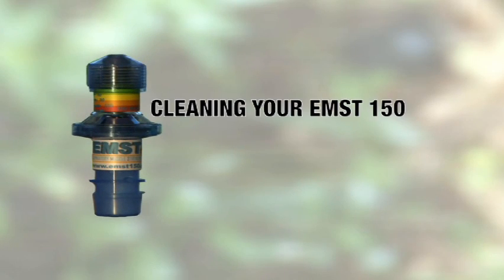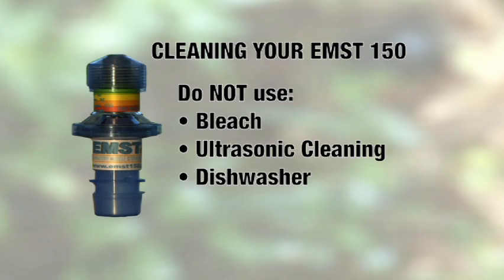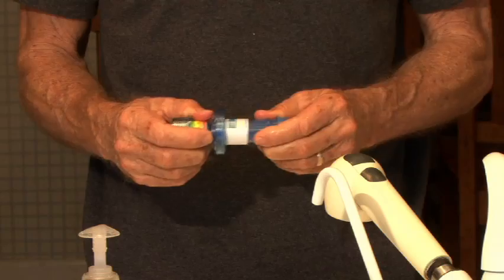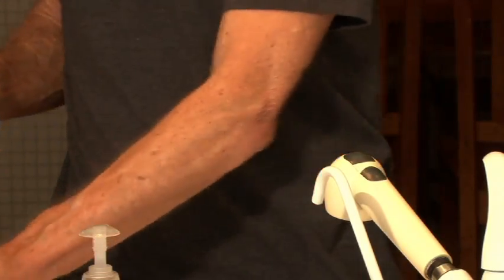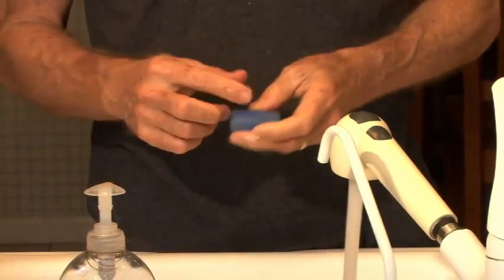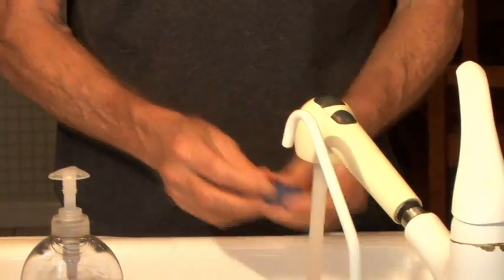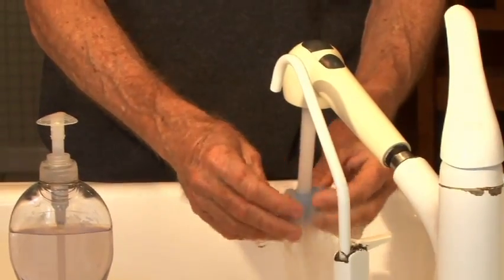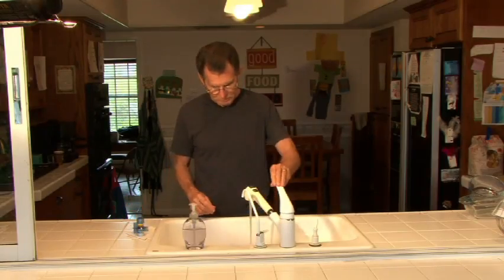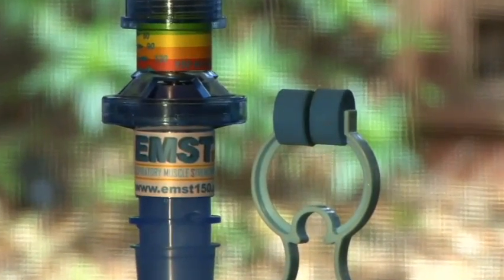Your EMST 150 trainer should be cleaned weekly. Do not use any harmful cleaning agents such as bleach or ultrasonic cleaning. The trainer is not dishwasher safe. In order to clean it, simply remove the mouthpiece from the unit. Set the unit aside as it should not be immersed in water. Take the mouthpiece and gently wash it with mild hand or dishwashing liquid in warm water. Once clean, put the mouthpiece aside to dry. Thanks for purchasing the EMST 150 expiratory muscle trainer.